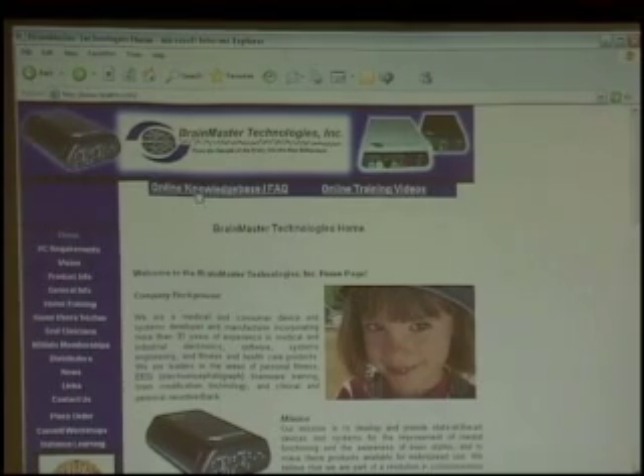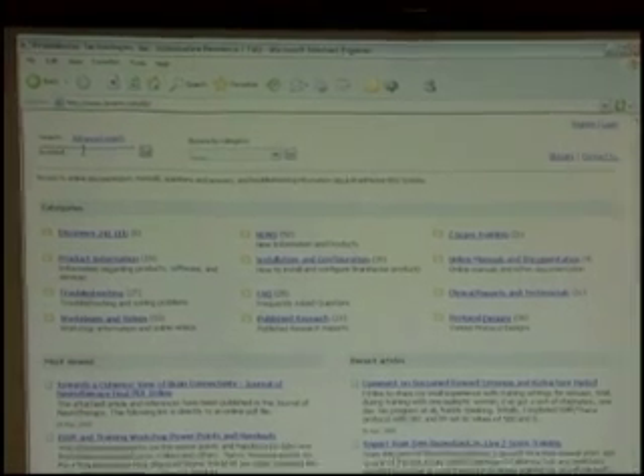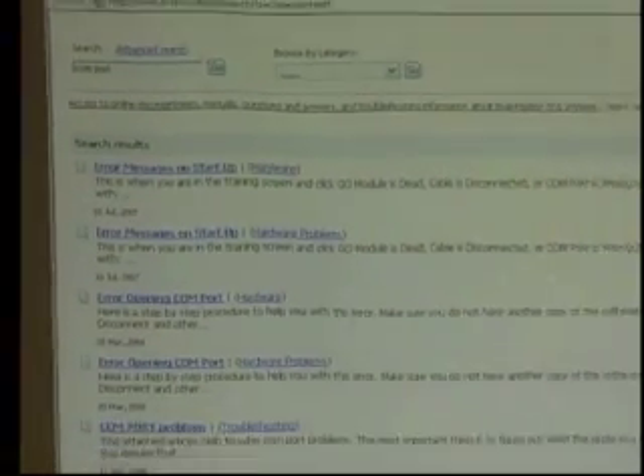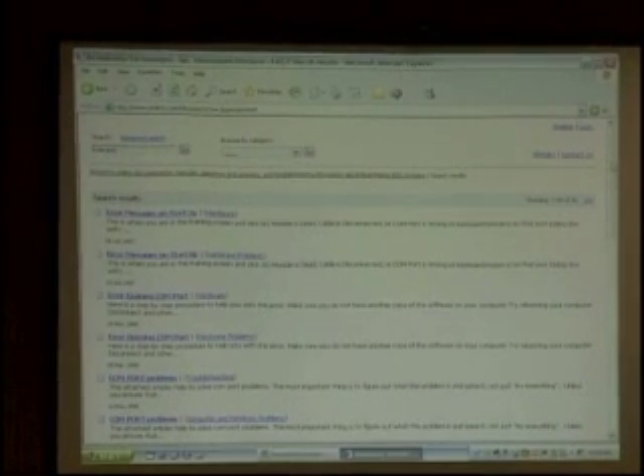Let's take one more quick glance at that knowledge base. I type in 'com port,' hit enter, and I get all the different articles — 46 different articles having to do with com port questions. So if you're stuck and the unit's not connecting or you're getting some kind of error, the knowledge base is a great place to get that first line of questions answered.